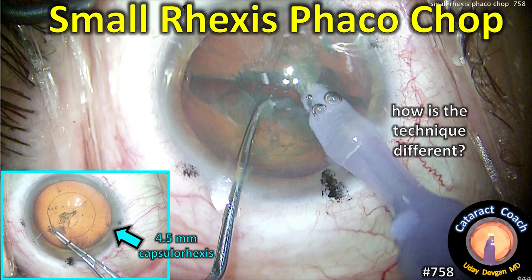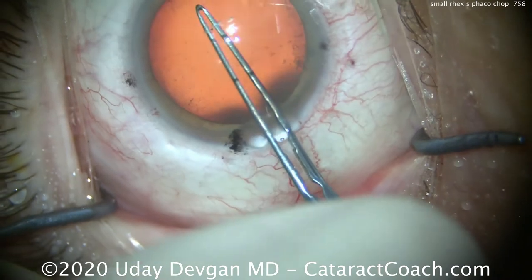CataractCoach.com — small rhexis phaco chop. So how is this technique any different when we're using a 4.5 mm capsulorhexis? Let's show you the surgery here.